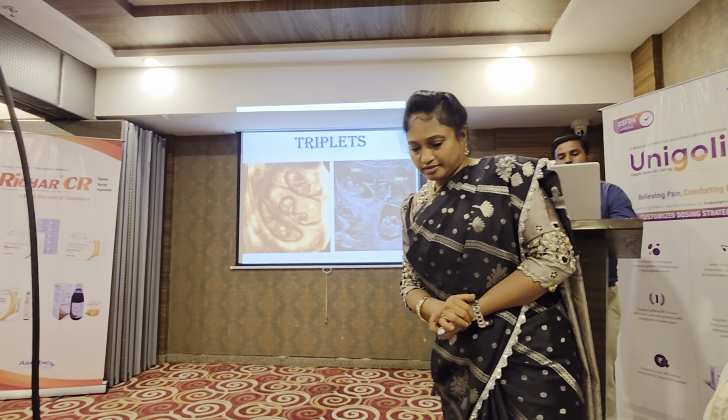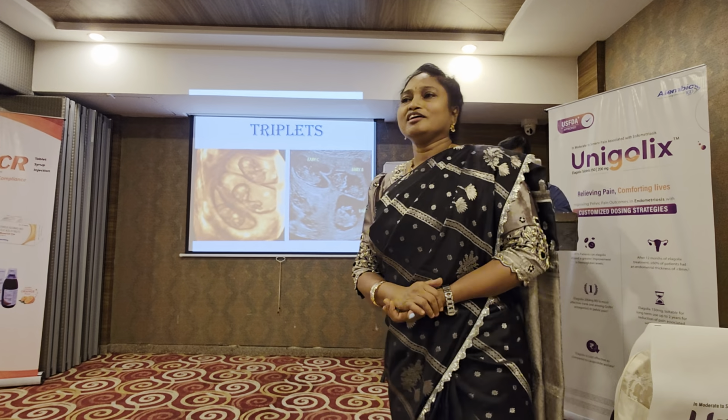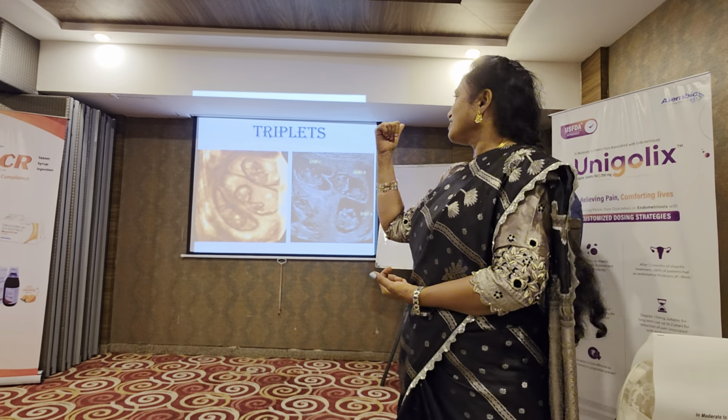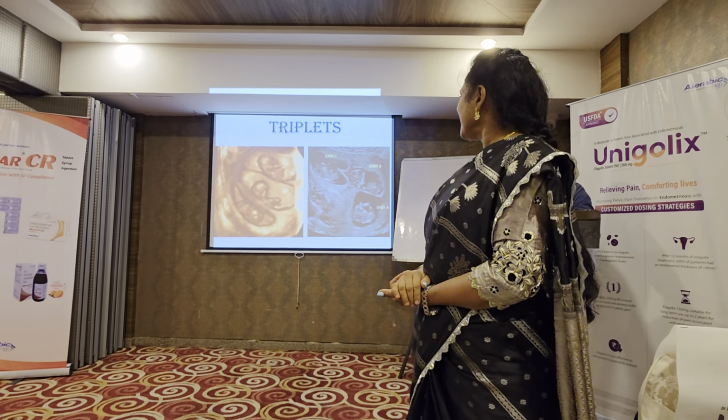So this is multiple pregnancy. This was a nice case of trichorionic, triamniotic triplets. This lady was almost 5'9" and she agreed to carry the triplets till term. So we went on with her till term.